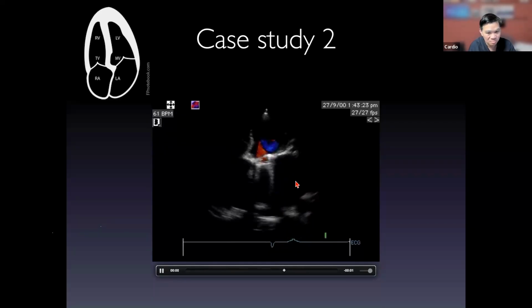Do you know why this is not real? Is that because that is the dark side of the moon? You're not supposed to see it? For those of you interested in astronomy, because of the rotation of the moon and the Earth, there's one side of the moon that you can never observe from the Earth's position.